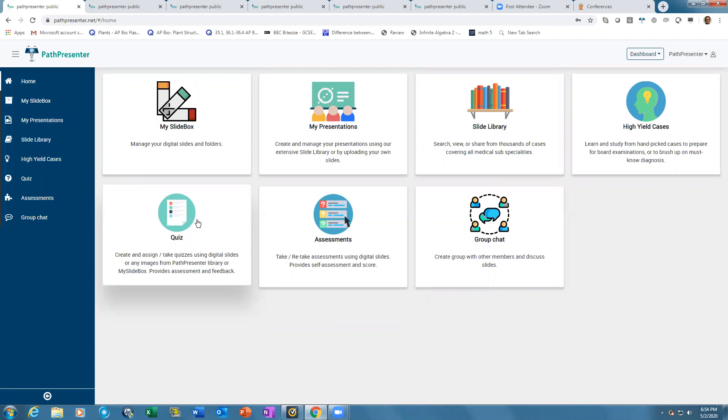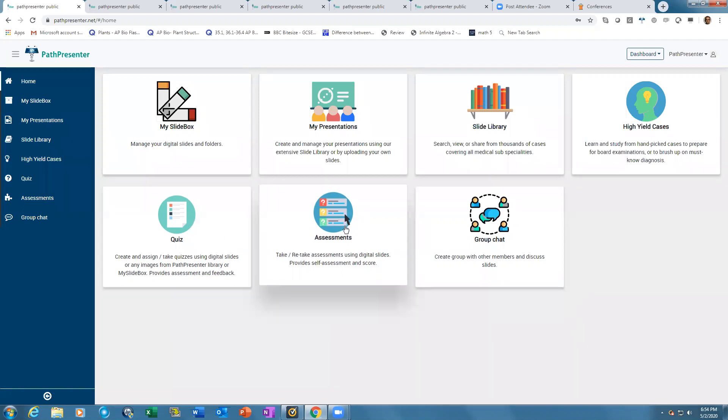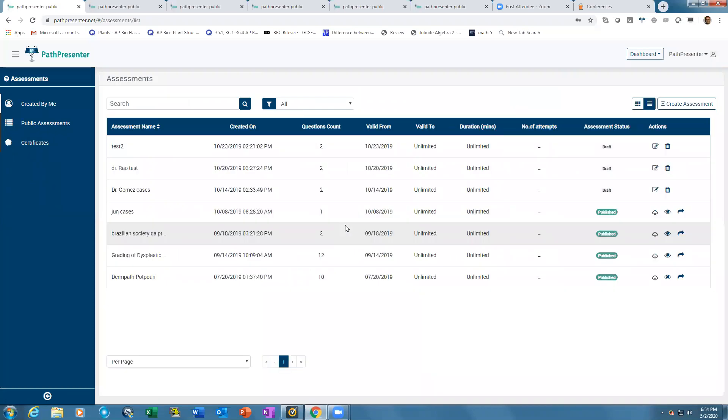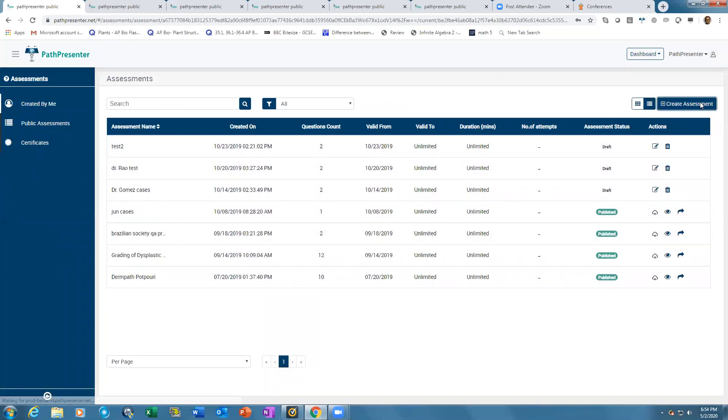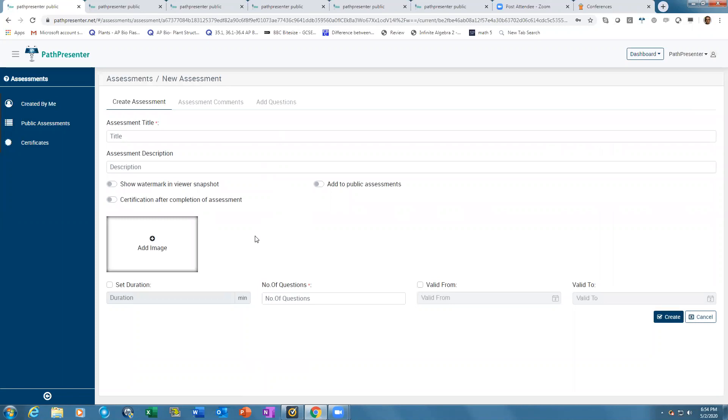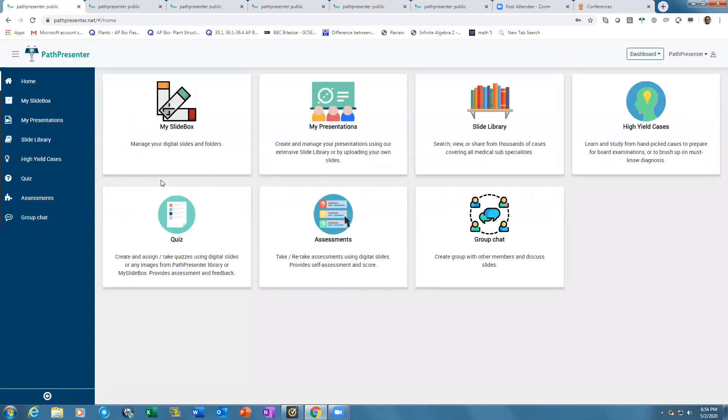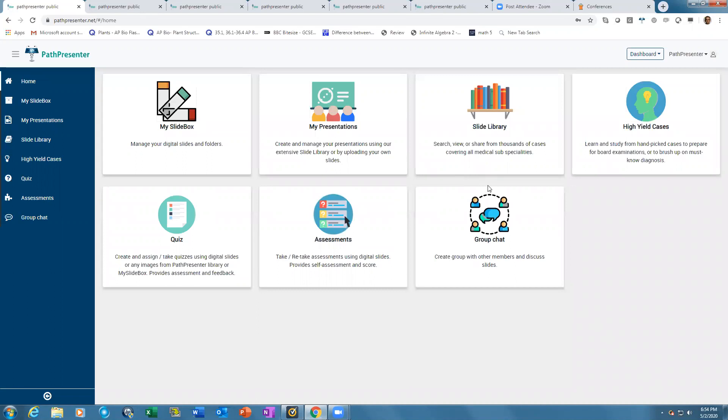Backend statistical modules allow creating visual representation of progress for evaluation. It's very easy to build an assessment and share it. Put in all the features, then add questions by adding digital slides or radiology images from your slide box or the slide library.